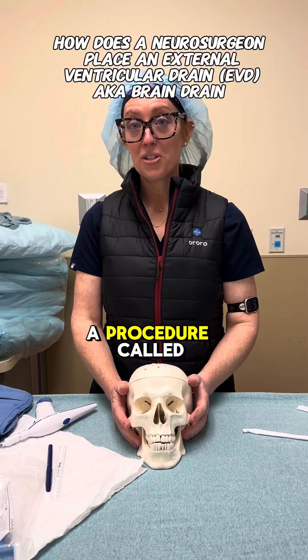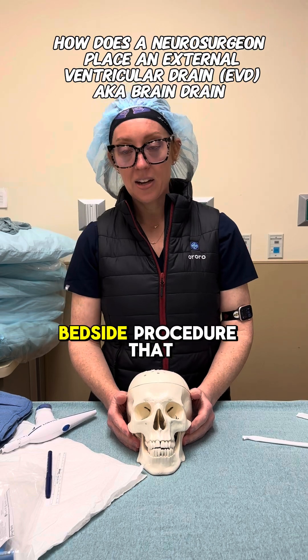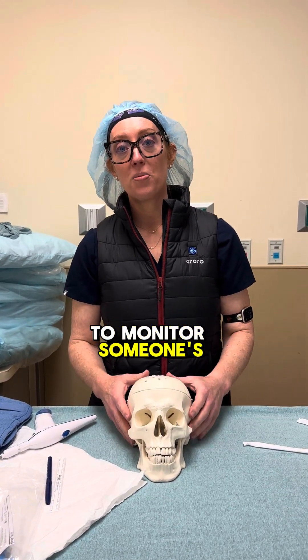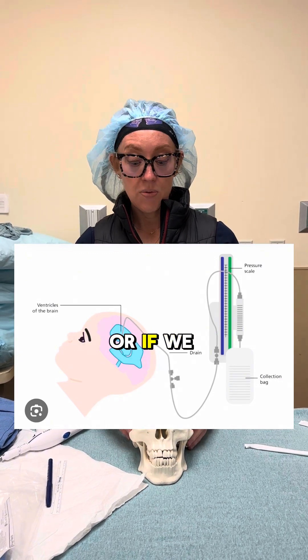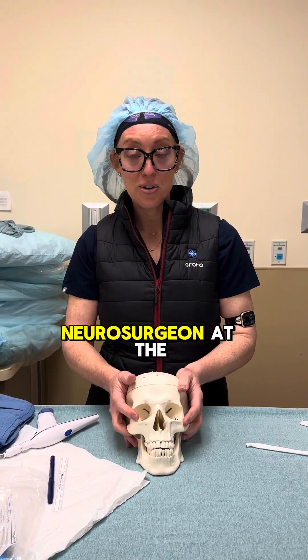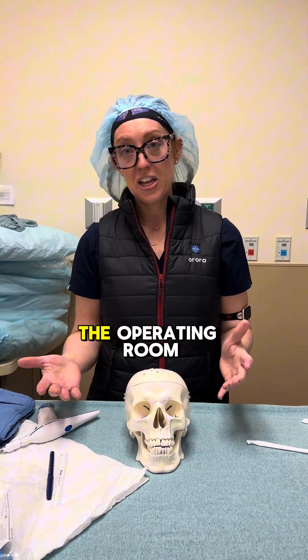I'm going to show you how we do a procedure called an external ventricular drain, which is a bedside procedure we can do in an emergency situation if we need to monitor someone's intracranial pressure, if they have brain swelling, or if we need to do this for hydrocephalus. As a neurosurgeon, we can do this at the bedside in the ER, in the intensive care unit, and even in the operating room.